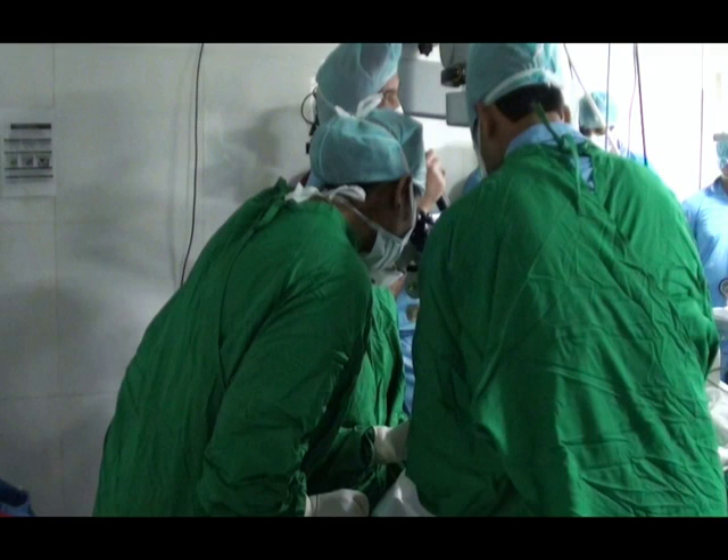For IA Venturi, this is the Tecnis one-piece lens of 18 diopters. The advantage of the Tecnis one-piece lens is that it allows you to give 3-point fixation because of the haptic design. The edge at the optic-haptic junction provides 360-degree protection against the migration of lens epithelial cells. He is using the same earlier cartridge that was used for Tecnis 3.